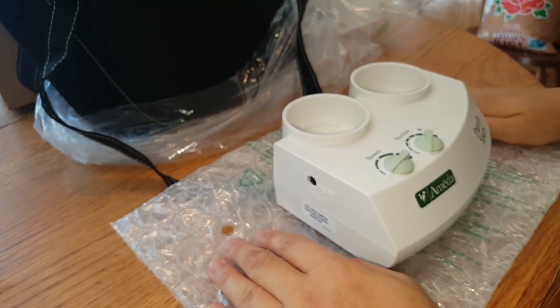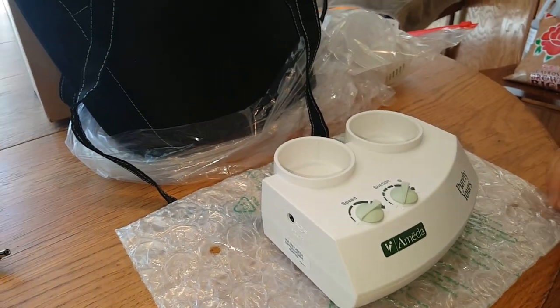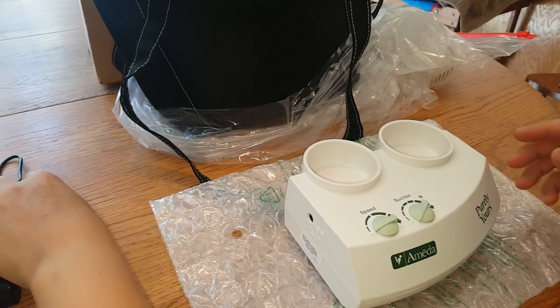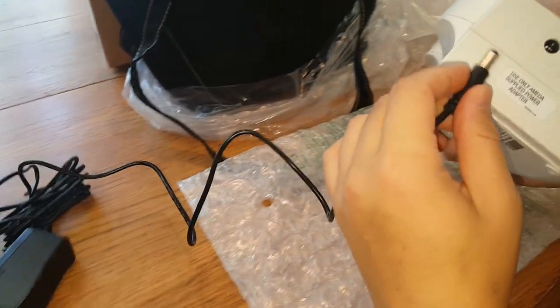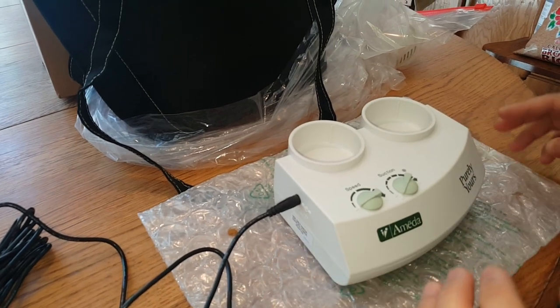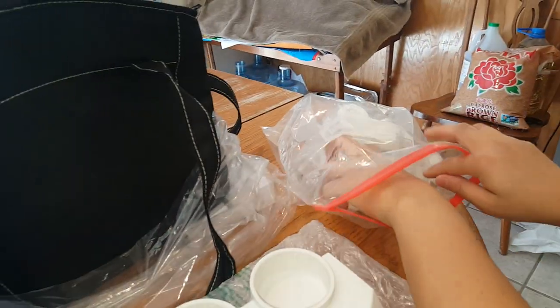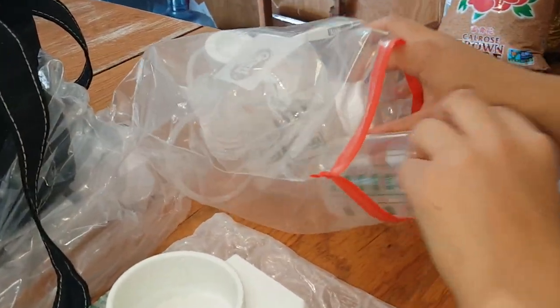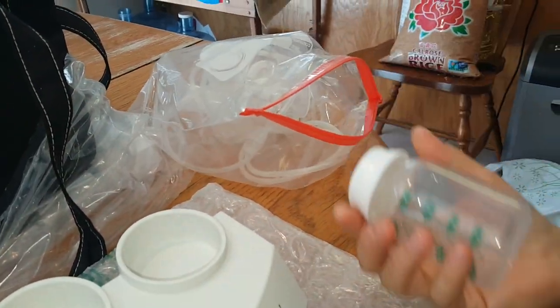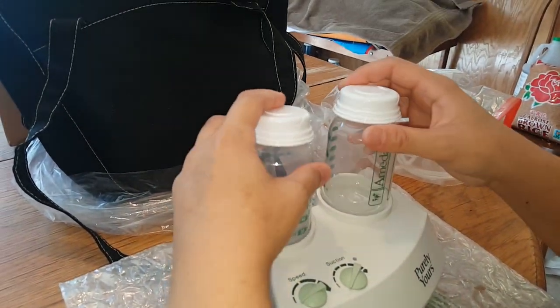So I love this pump. I've used it for years — I would say 10 plus years — and it's never failed me. It works well. The suction has never been a problem for me. I usually can express about 4 ounces each side per sitting, so every 2 to 3 hours, that's how much I get.